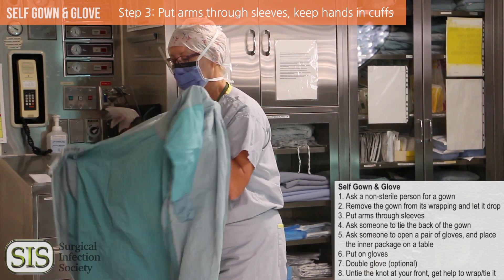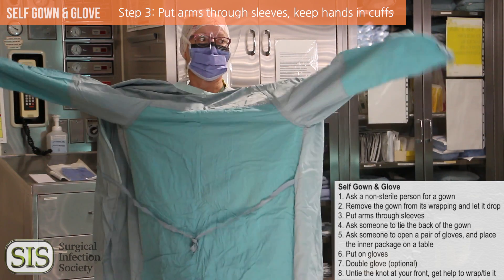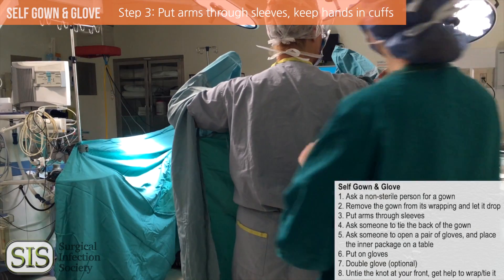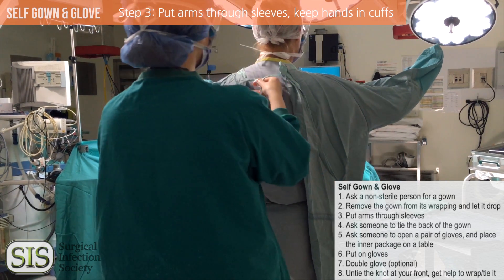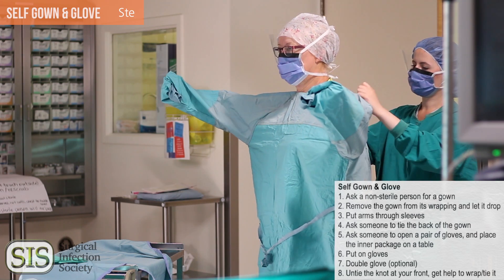Put arms through sleeves. Carefully open the gown and hold it up by the arm holes. Shrug your arms into the sleeves, keeping your hands inside the cuffs. You will keep your hands wrapped into the cuffs until you get your gloves. Ask someone to tie the back of the gown.